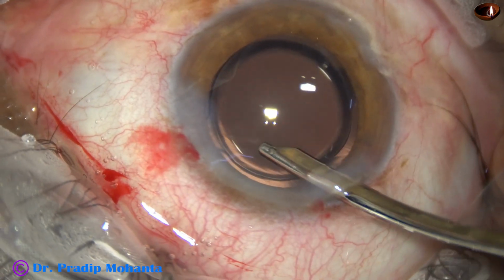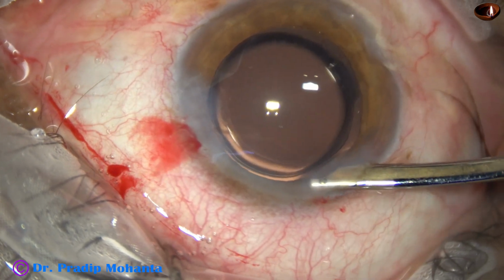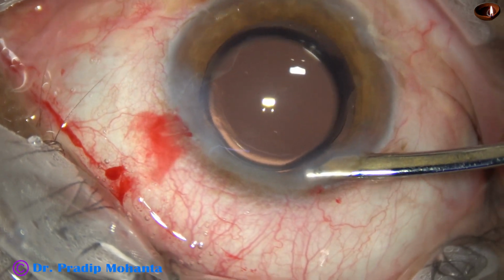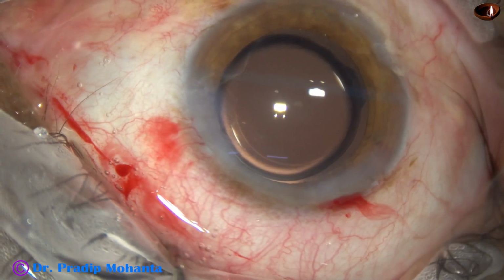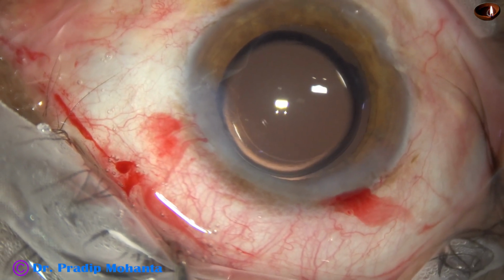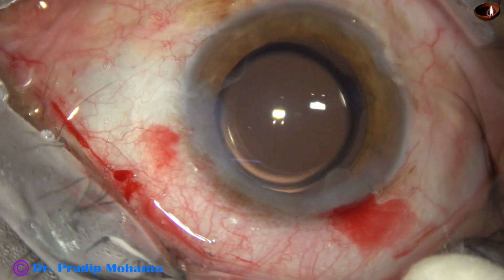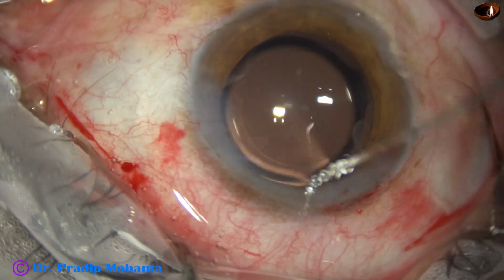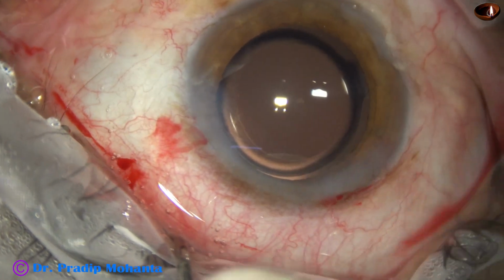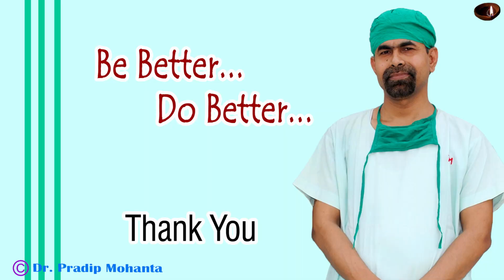I like to form the anterior chamber with Simcoe in this way. The Simcoe is placed in the tunnel, kept for some seconds, and then comes out. And most of the time, almost 99.5% of the time, the main wound doesn't require any hydration. The main thing is we have not stressed the main wound.